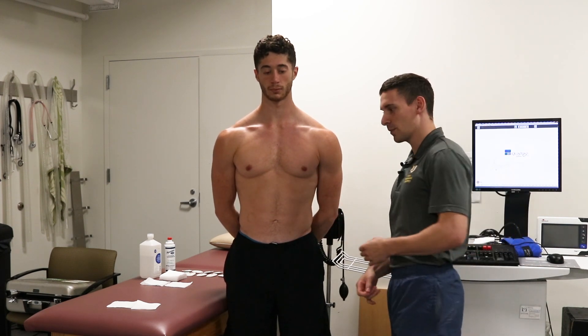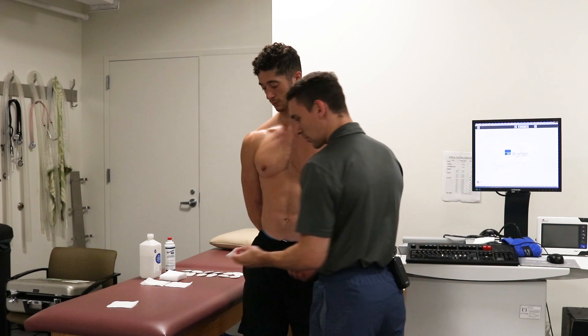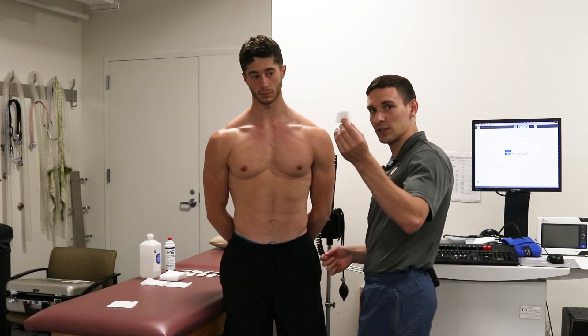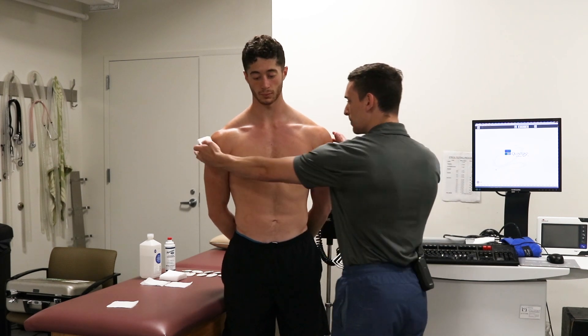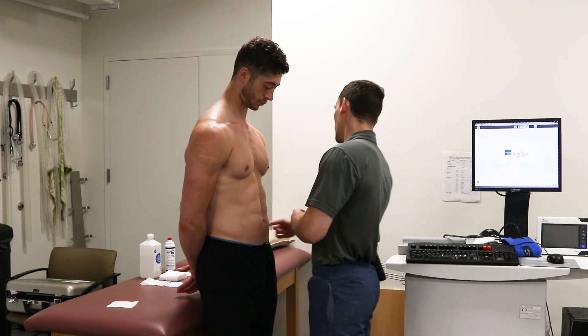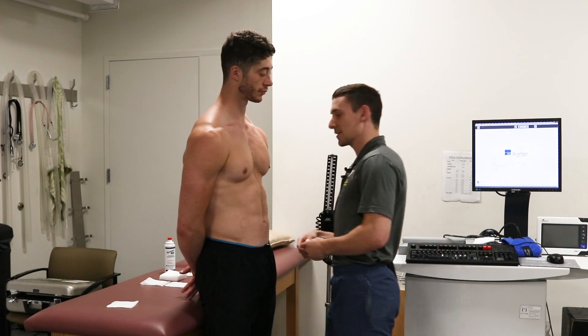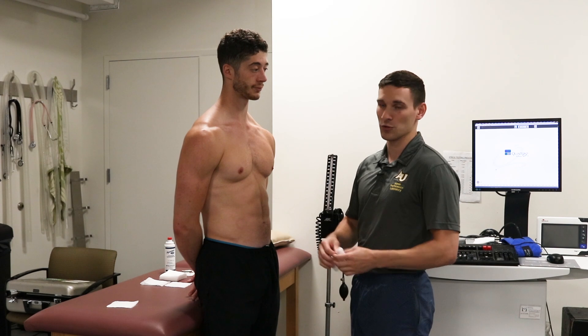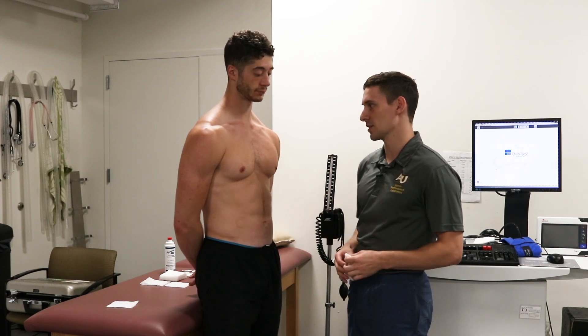This entire prep is all about making sure that our electrodes hook up nicely and we're getting a clean, clear signal. Primarily using our gauze and alcohol, we are going to be abrading the skin, making sure that all of the dead skin is worn off so that the electrodes will not fall off and we're getting a nice signal through.